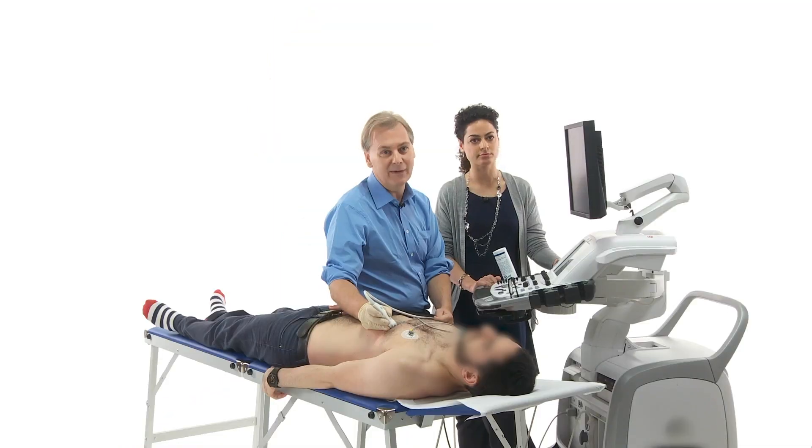The second teaching point I want to make as a final closing remark is it's even possible to position patients on intensive care units if we only try a little bit, and that might help too.